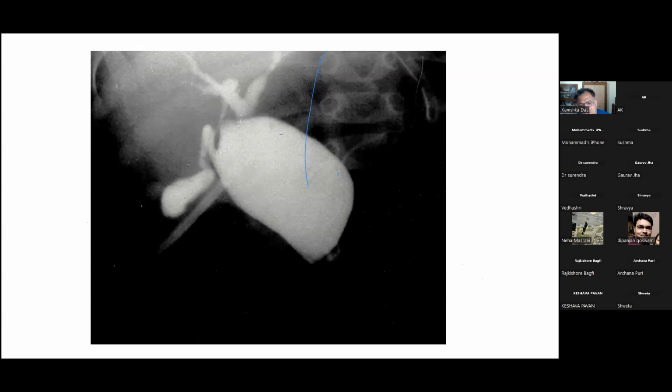Could the cholangiogram we do also be ERCP, sir? Yes, ERCP also, if you can see an endoscope. In ERCP, you will have something going down from here. Can you see something there? Yes, a tube you can see. This is a tube. In some particular case, they have put in a tube there and they're doing a T-tube cholangiogram. Very unusual situation. Okay, go ahead.